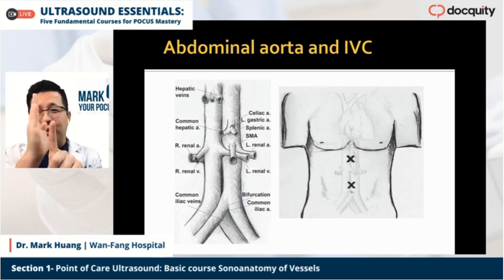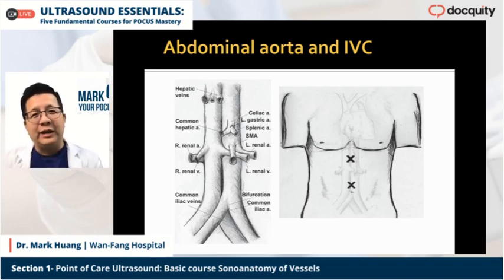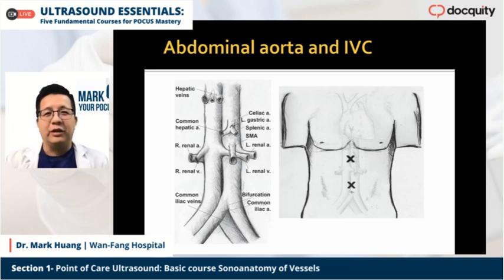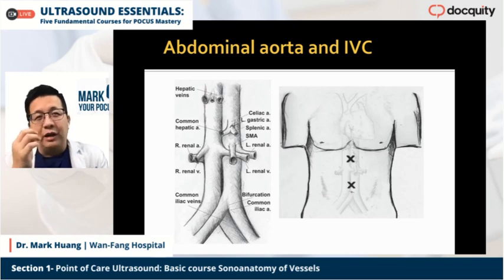What kind of manipulation? We only use the tilting. It will help you to find the IVC. So don't do too much sliding, because when you slide more, you will lose your orientation and you will miss your target. Okay, so it's a very, very important skill and very crucial skill.